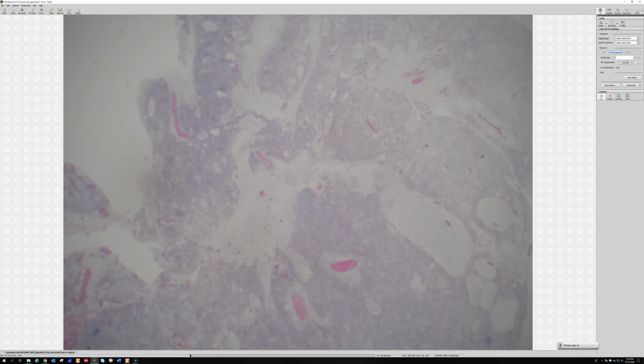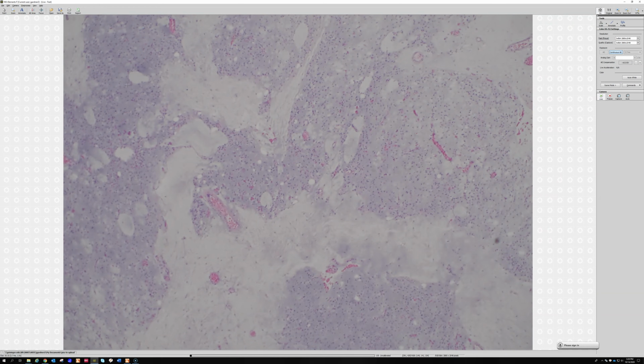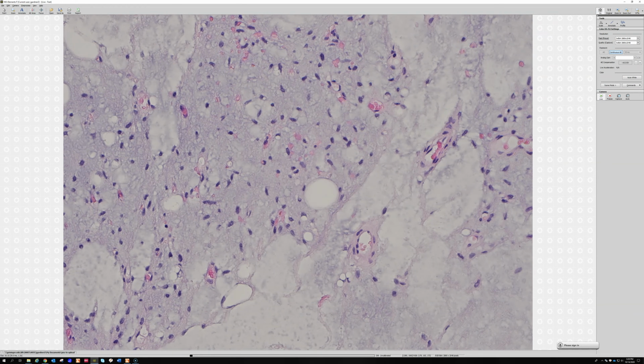If you see atypia or pleomorphism, you're almost certainly not dealing with myxoid liposarcoma. These are bland, very benign looking. And here's some, let's see if I can get it in focus. See, there's a little bit of adipose stuff, some scattered mature fat cells, and then the lipoblasts are going to be, there we go, little guys like that.